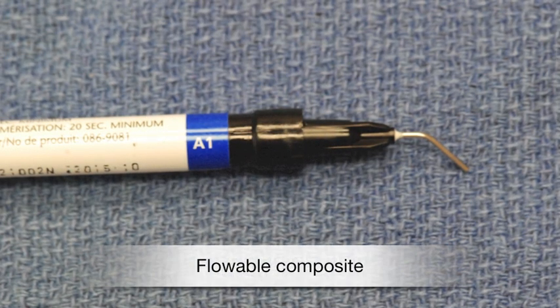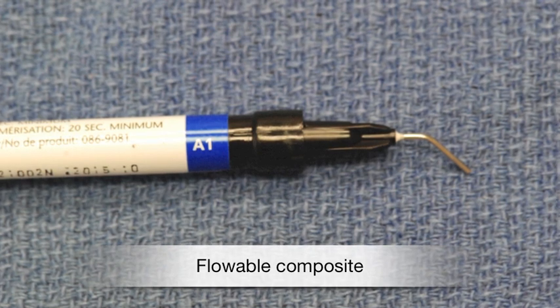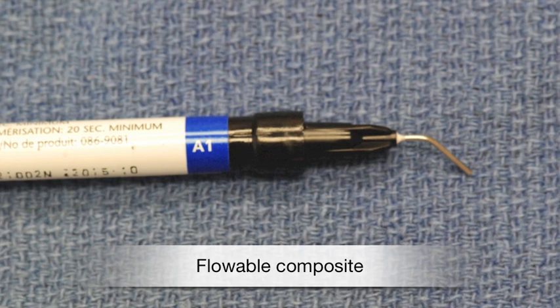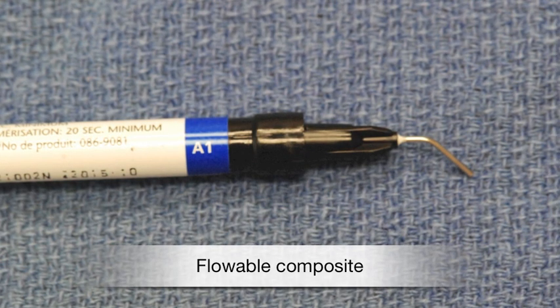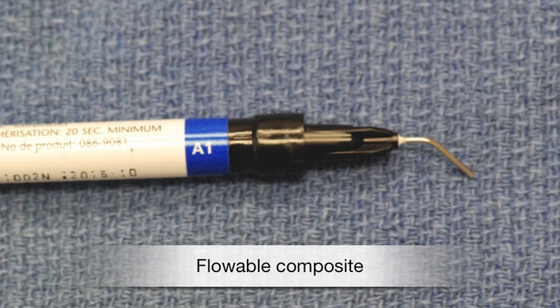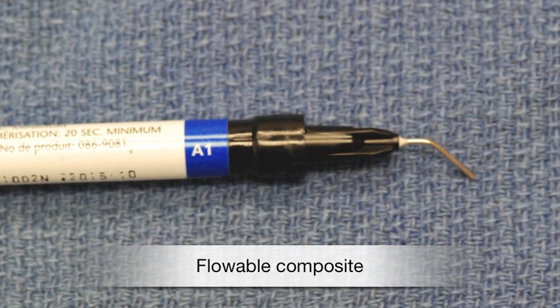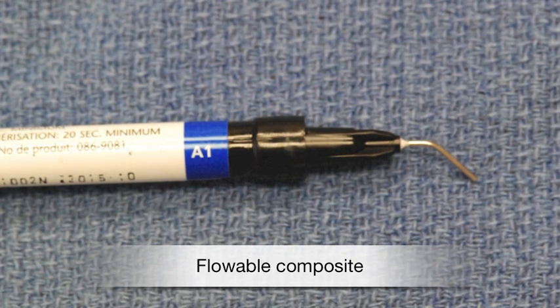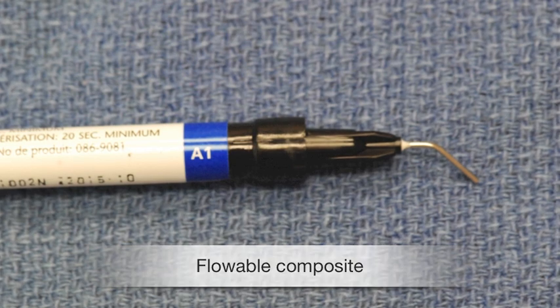Flowable composite is a material chemically similar to bonding agent, but containing many small particles of silicon dioxide, also known as quartz. The silicon dioxide gives the resin hardness and color. With only a small amount of silicon dioxide, the material is like thick honey and will flow into small crevices, but not so fluid as to move into all of the etched surfaces of the teeth after etching — thus the need for bonding agent.